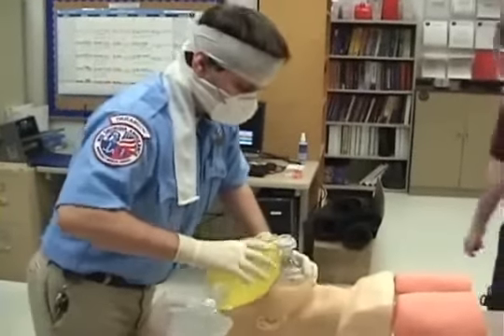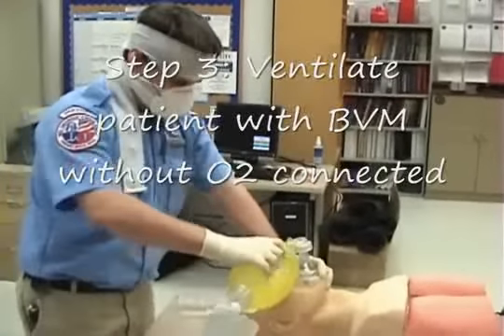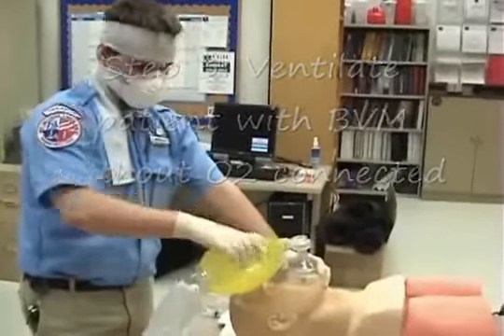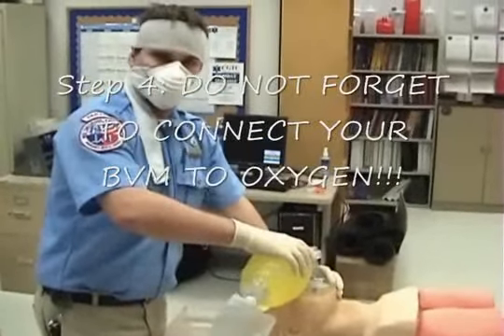Then what we're going to do is ventilate our patient with a BVM with room air while we're waiting for the oxygen. And then connect the BVM to oxygen and pre-oxygenate our patient for about 30 seconds.